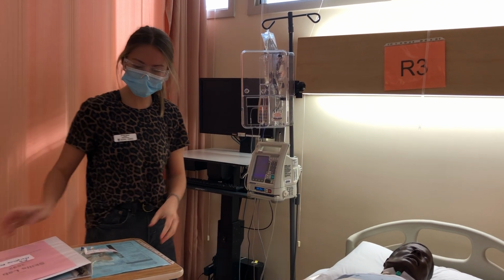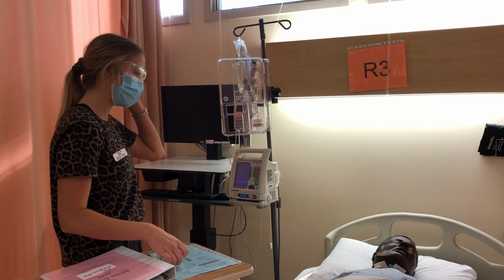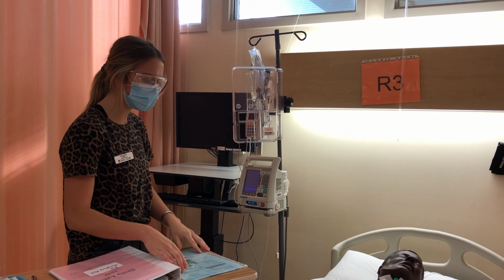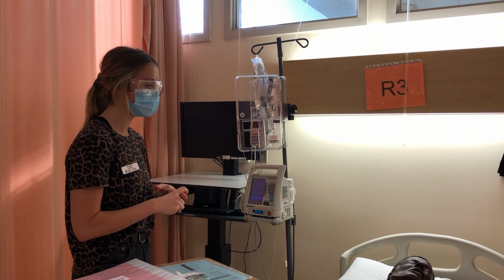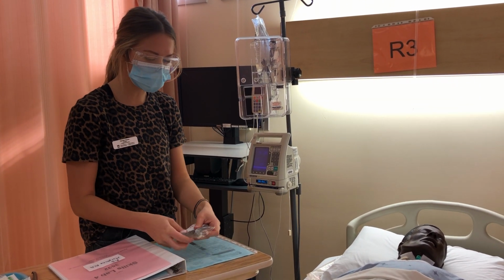So the doctor ordered for the PCA bag to be changed. Looks like we've been having this for a while. We're going to be continuing to monitor you to make sure your pain is well controlled. We'll be taking your vital signs pretty steadily as well, and we'll monitor you for any signs of respiratory depression, nausea, vomiting, anything out of the ordinary. Make sure you just alert us so we can check in on that.